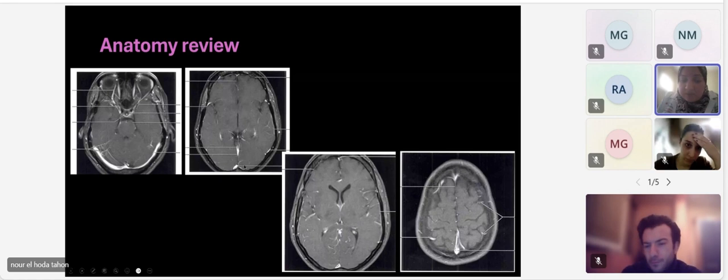This is part of the confluence of the venous sinuses, and as we said, this part of the straight sinus starts to have the deep venous system here. Sorry, the internal cerebral veins. And this is again an example of dural enhancement that looks okay. And the cortical vessels.